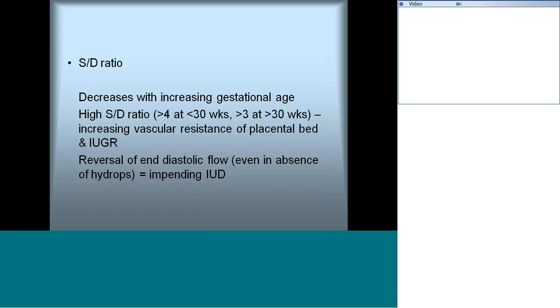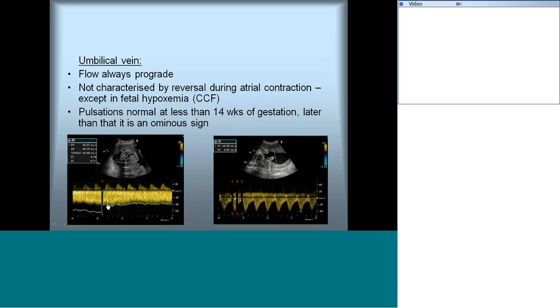The umbilical vein in the umbilical cord is a venous structure with continuous prograde flow showing an S-D wave pattern. There is normally no reversal during atrial contraction, unlike the IVC or hepatic vein Doppler. If reversal is present in the umbilical venous Doppler, it is abnormal and indicates a congested cardiac state. Also, pulsation in the umbilical venous waveform later in gestation is considered an ominous sign.